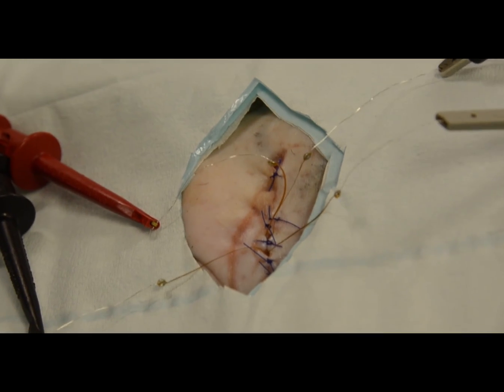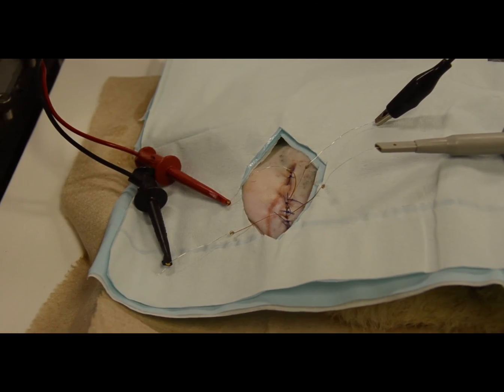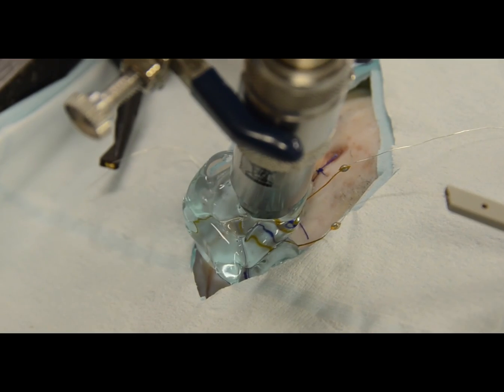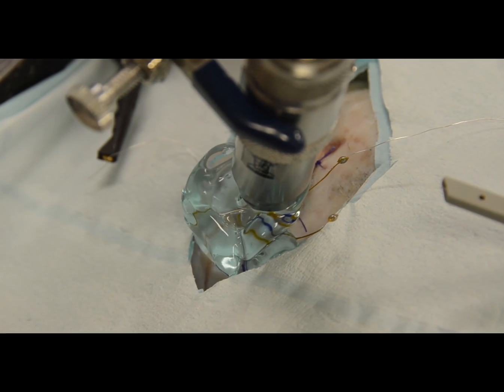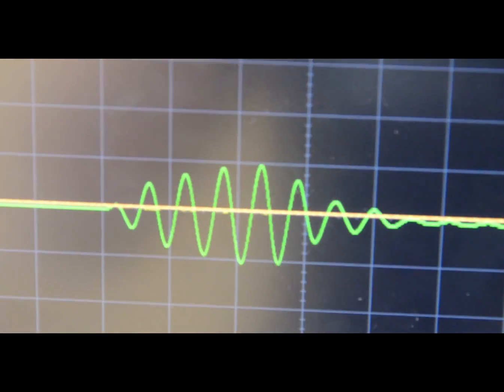Once implanted, the wound is sutured closed, leaving the test leads exposed to validate wireless recordings. Commercial ultrasound gel is used to enhance coupling and the external transducer is aligned to produce the largest return signal at the time delay corresponding to the transducer's focal distance.